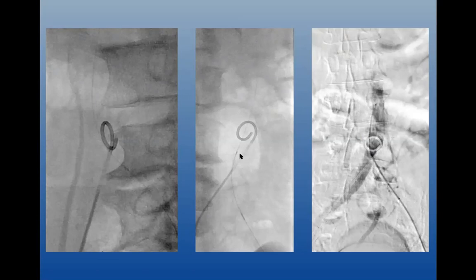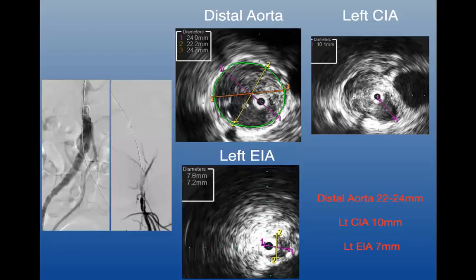I knew that I had crossed this iliac artery in a very favorable location here based on the previous cone beam CT before I'd punctured that last part to get in, and a contrast injection with a catheter showed that I was intraluminal. So, kind of basic techniques that you all know.